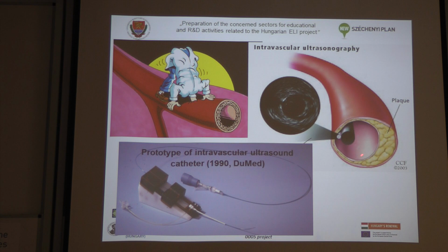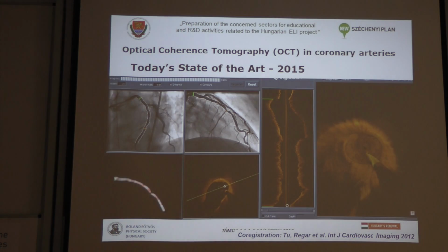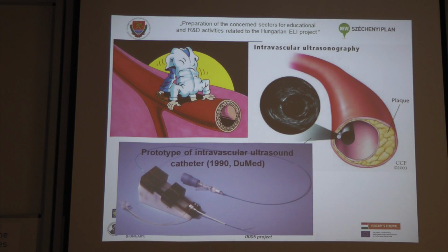So the first possibility to examine it in the living human body was the introduction of the intravascular ultrasound catheter.